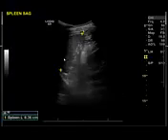And so there is a huge cystic area related to the lower pole of the left kidney, 12.7 by 13 centimeters. And again, always look at the back wall, because acoustic enhancement indicates that it's a poor attenuator, and it always should describe the wall. So that's a huge renal cyst off of the left kidney. Another renal cyst, the big one, and there's the spleen.